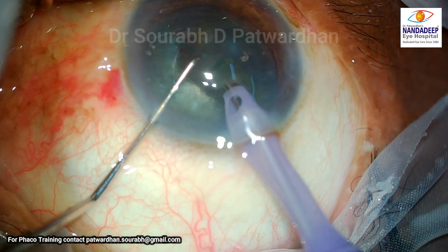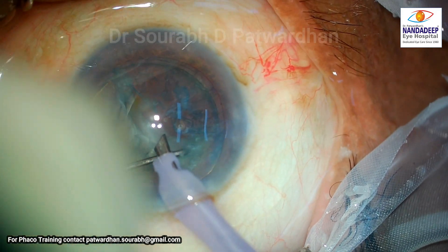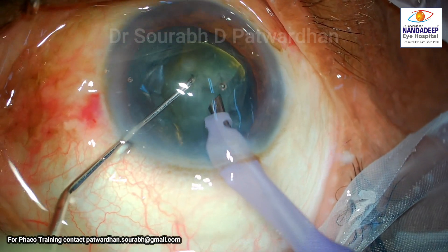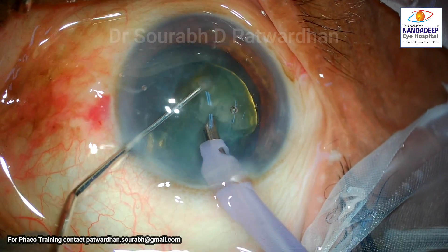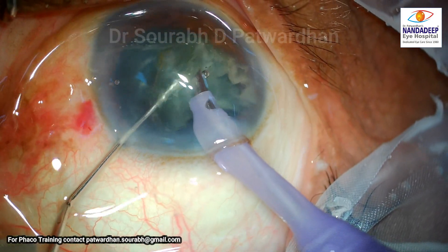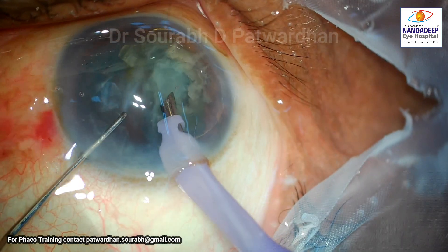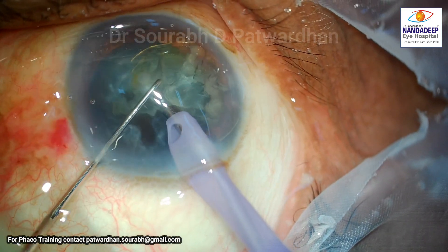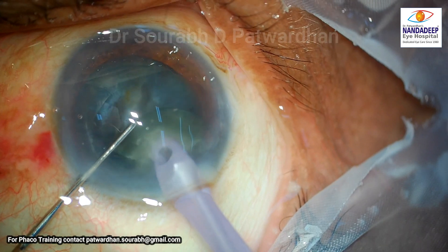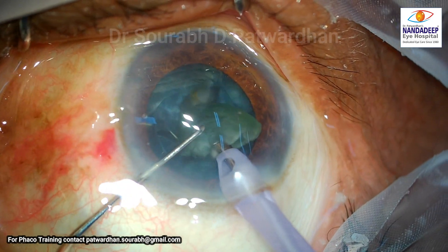Watch the phaco probe here — the surgeon is withdrawing the phaco probe into the incision, and the globe is now getting rotated downward because of the push of the phaco probe. I would prefer to divide the whole nucleus into four quadrants first before taking out this hemi-nucleus. There is now no support from the other half, and the surgeon cannot chop it well. At the same time, the surgeon is losing globe control as it rotates downward, the phaco probe is being withdrawn into the incision, and phaco is very anterior — all three things are not good.